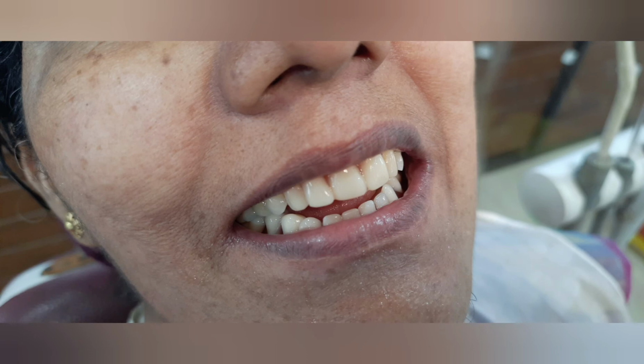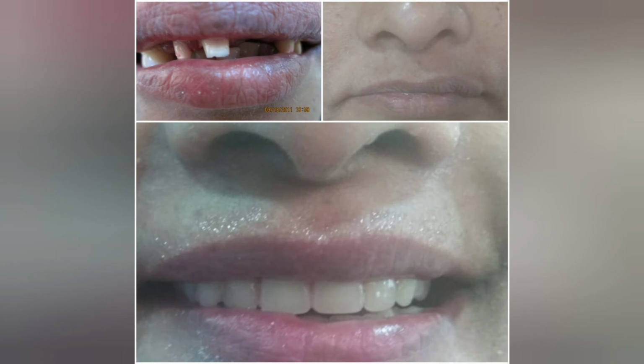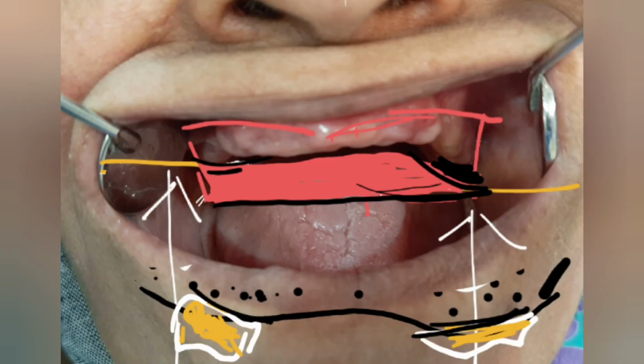Setting a proper occlusal scheme is the key for a successful denture, and an ideal upper anterior setting has to be followed. The relationship is more important, not the teeth placement. I mean, if there is a discrepancy in the ridge when viewed from the frontal plane, the rim has to follow the relative occlusal plane as planned. That's why I said relationship is important.